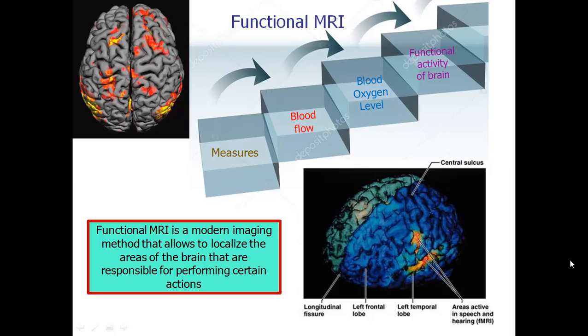Thus, the images generated by MRI scans are like three-dimensional pictures of anatomic structure. The images generated by functional MRIs are images of metabolic activity within different anatomic structures responsible for sight, sense of smell, hearing, and so on.